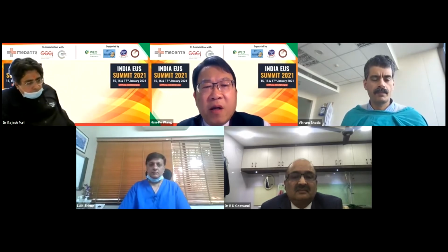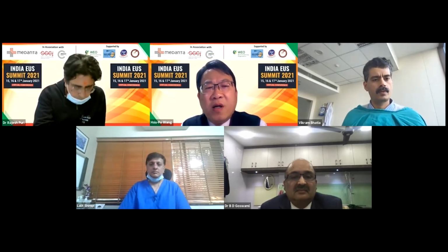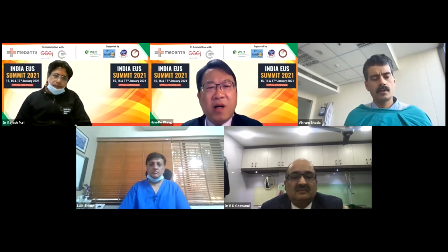We separate it into two parts, because fluid-based cytology usually has a very low yield rate. But we try to make the smear in the endoscopy room, and for the solid part we make the smear by ourselves. If the cytologist can come, we discuss with them. If not, we make a tentative diagnosis, because we learn from the cytology in every case and experience.